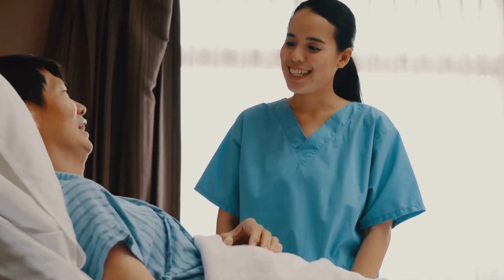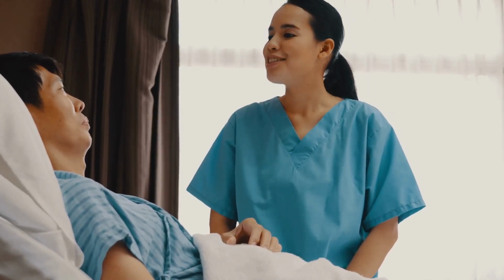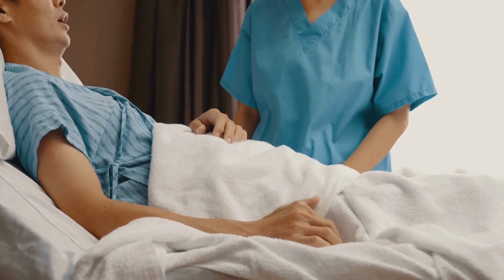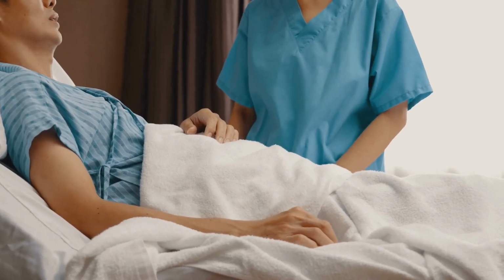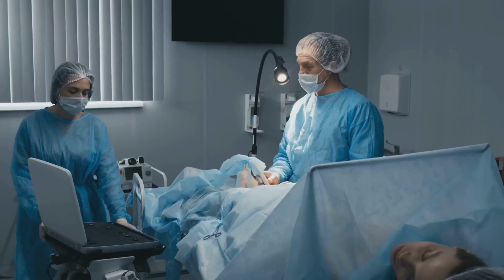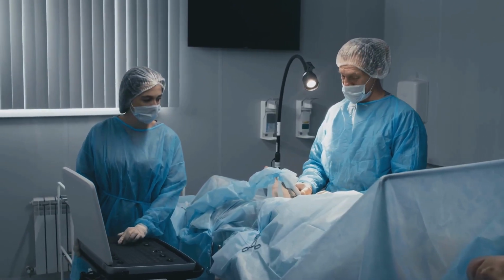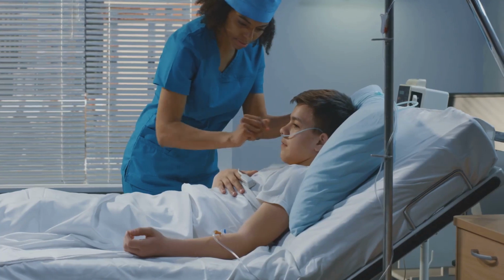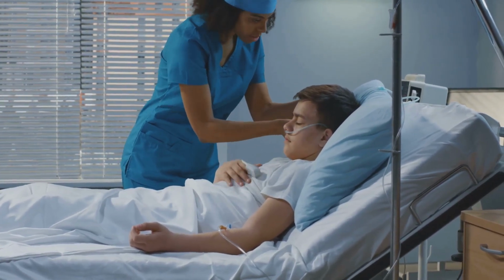It's also important to note that the patient's comfort should always be taken into account. Ensure that they are relaxed and comfortable in this position before proceeding. If they are tense or uncomfortable, it can make the procedure more difficult and potentially increase the risk of complications. In some instances, a slight modification to the patient's position might be necessary, depending on their unique anatomy or comfort. Always remember to be flexible and adapt the positioning as needed to best suit each individual patient.